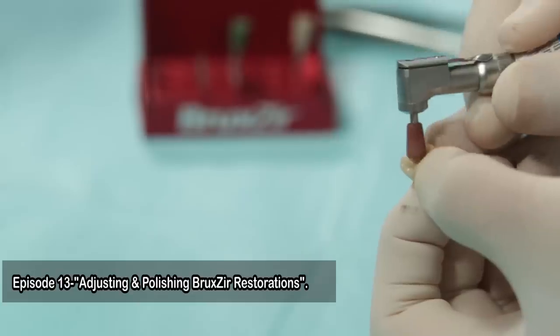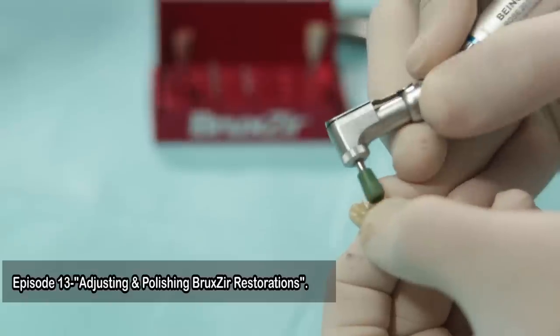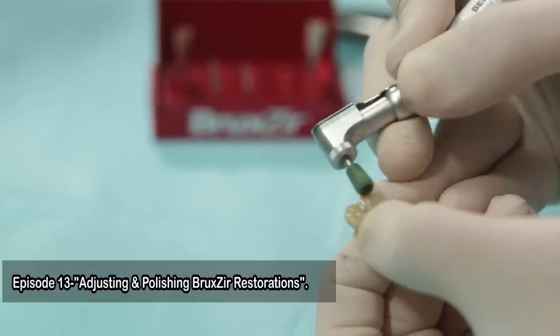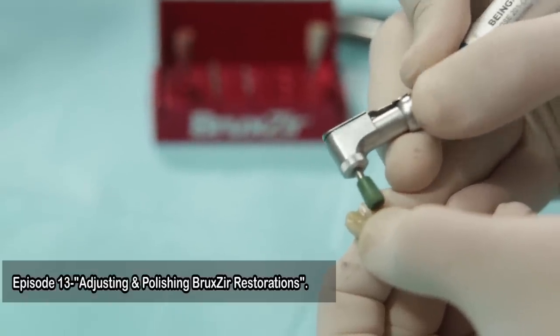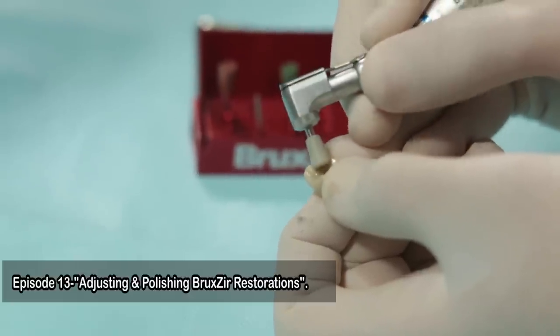Chairside has a perfect answer to this question. On episode 13 I had showcased a special kit meant to finish and polish zirconia restorations, but since that kit is extremely difficult to get, I have an easier and more economical solution for you. I present to you these silicone wheels, which are meant to provide ultimate smoothness and a mirror finish polish surface on your crown and bridge restorations. This kit is very easily available with chairside.